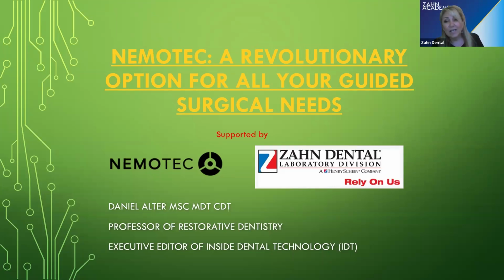Daniel is an MSc, MDT, CDT. He is the professor of restorative dentistry for the City University of New York and also the executive editor of Inside Dental Technology magazine, IDT. So we're so thankful for you to be with us today, Daniel, and to give some insight on this really great software for our laboratories to take a look at and possibly want to incorporate into their lab.